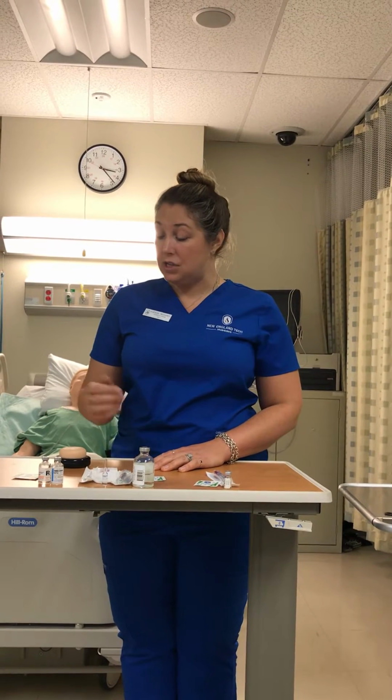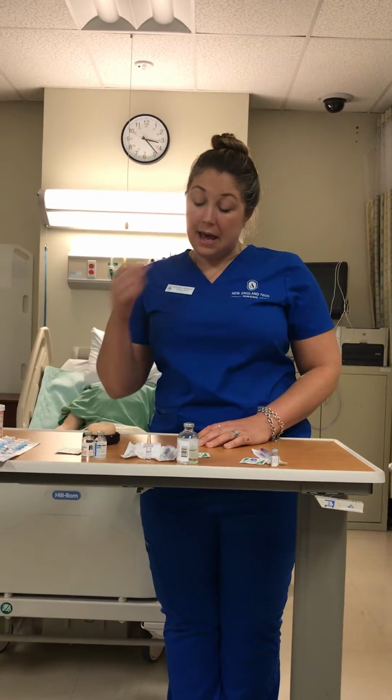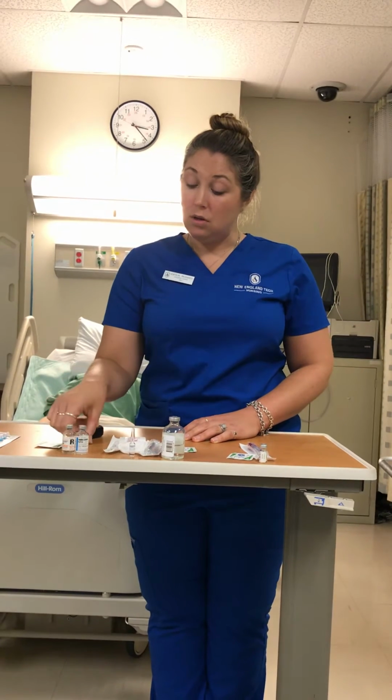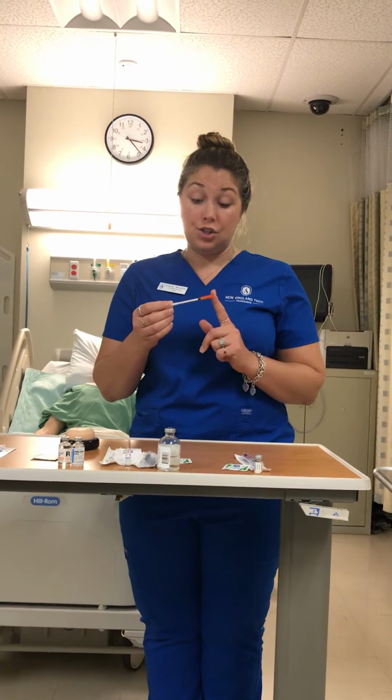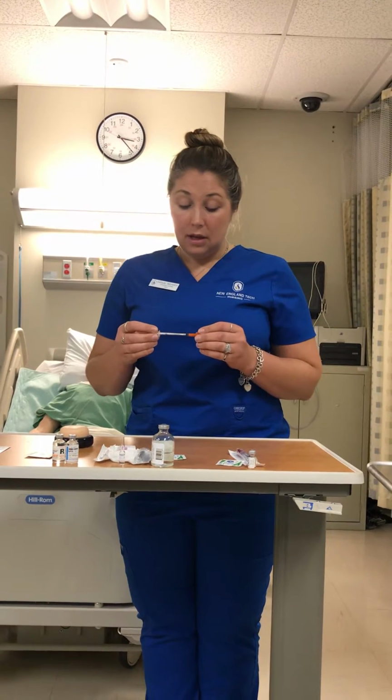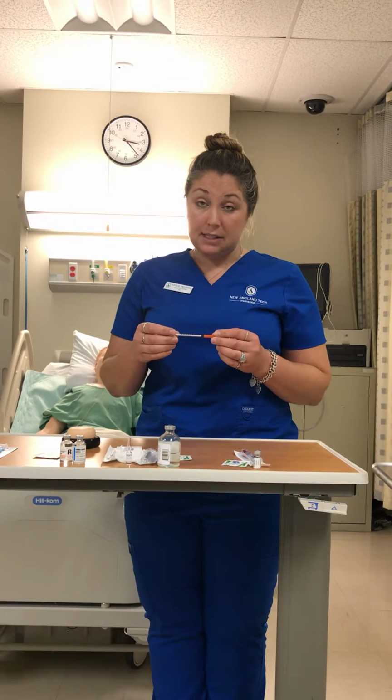So the first kind of medication that I have here is insulin. You want to make sure that when you're administering the insulin, that you have another nurse check. You also want to use an insulin needle, which has an orange cap on it. There are 3 different places to place the insulin.